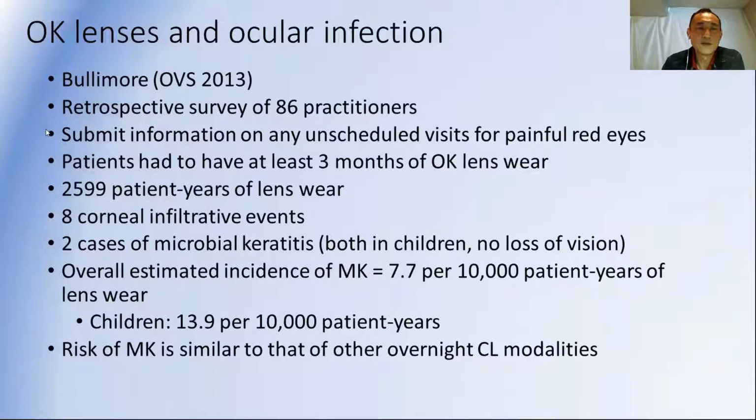Mark Bullimore found that overall, in his studies and his surveys, the risk of microbial keratitis is very similar to that of other overnight contact lens modalities. So if your patient's parents are concerned about infection, yes, there is an increase in risk of ocular infection compared to no lens wear, and probably a little increase in risk compared to daily lens wear, but compared to other overnight modalities, it's very similar.